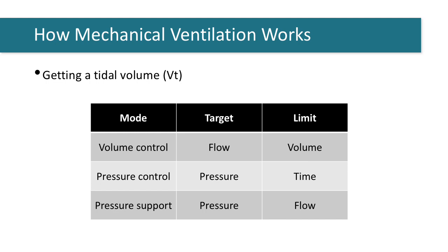In pressure-controlled ventilation, the target is pressure, that is, how much the pressure increases to drive flow of gas into the lung, and the limit is time. That pressure will be applied for the duration of time set on the ventilator.